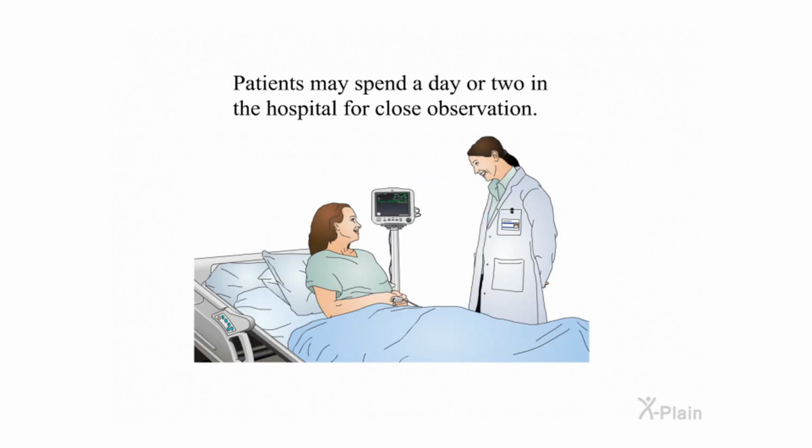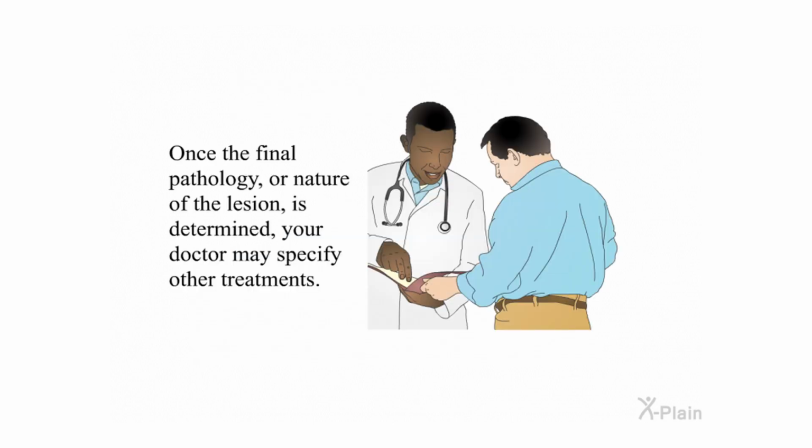After the surgery, patients may spend a day or two in the hospital for close observation. Once the final pathology or nature of the lesion is determined, your doctor may specify other treatments.